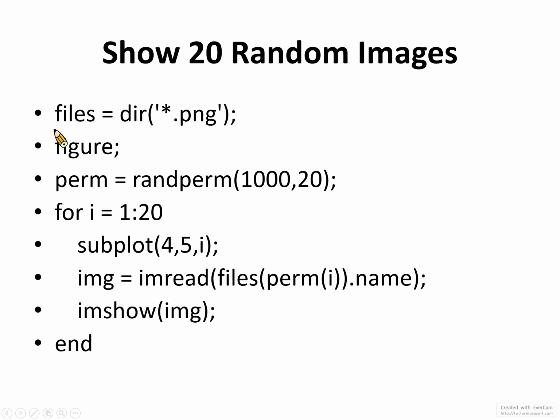This line of code should give you 1,000 file names in the variable.